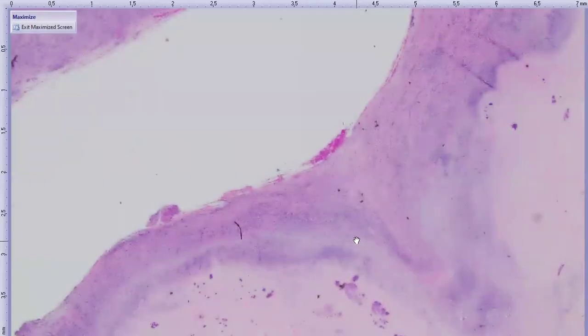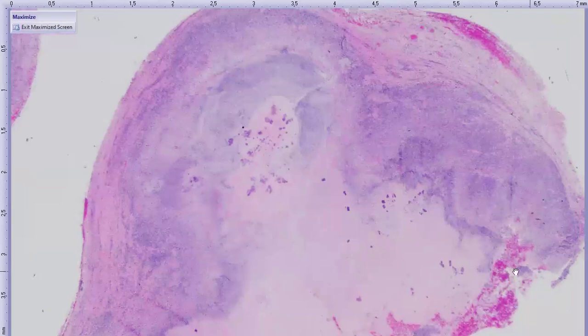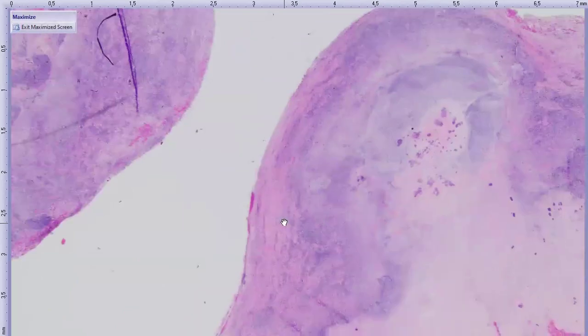I'm going to quickly show you the slide that really bit the big one in the great disaster this morning. Let's see how this is going to work. It's not. Hold on. So this is the orbital tissue that is just greatly expanded by this inflammation. And you can see from this very low magnification how numerous those bacterial colonies are and how large they are. Let's go higher mag, even though it's very sad that this slide is dead.